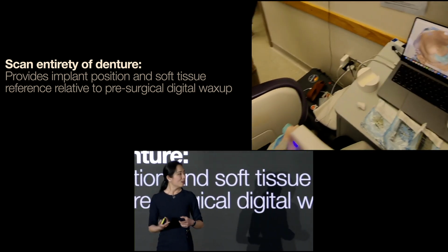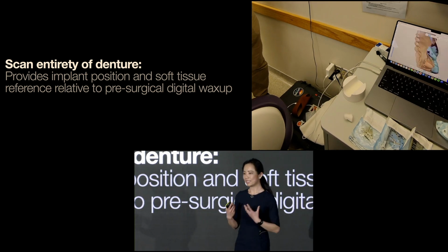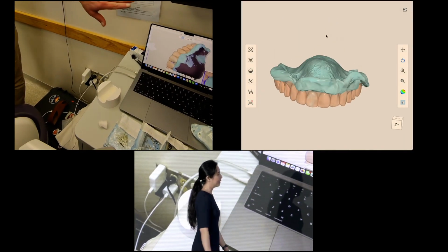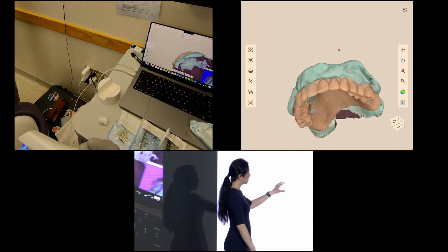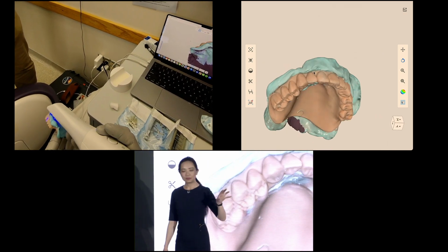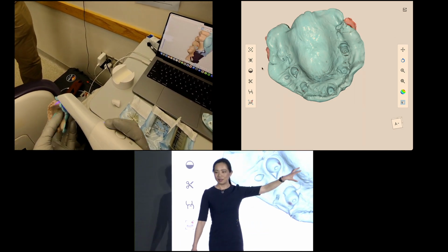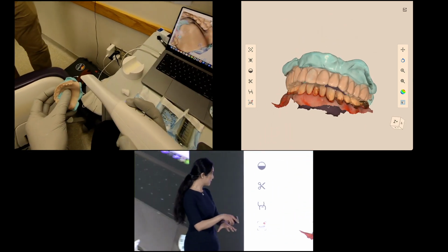So at this point, I'm not relying on biologic markers, but straight up relying on my digital data being accurate. From there, you can see the scan and where the white caps are. The important factor is not getting a perfect impression of all of the white caps. The most important factor here is reestablishing the positioning of at least 2 to 3 of these white caps back into where the teeth setup is on exocad.